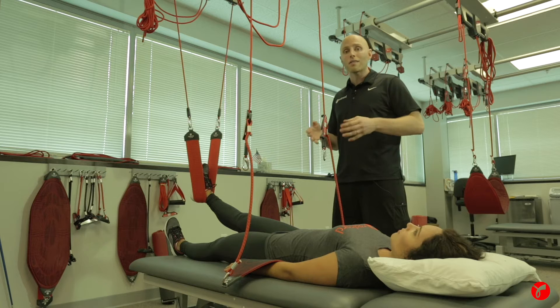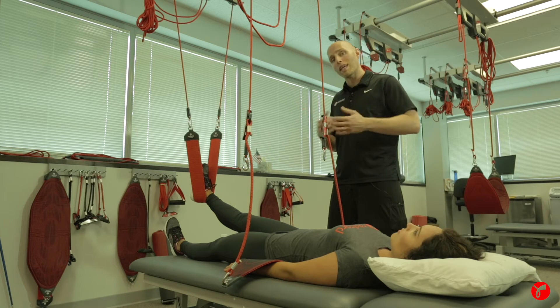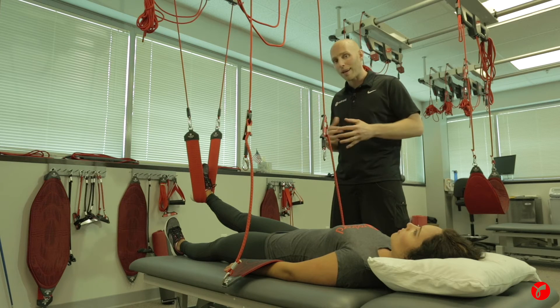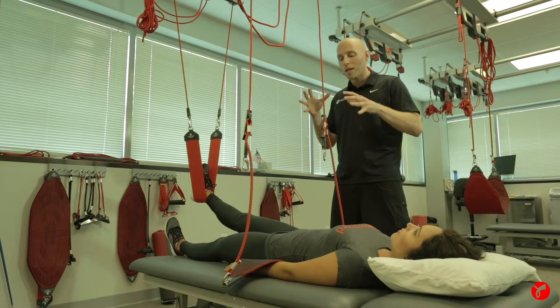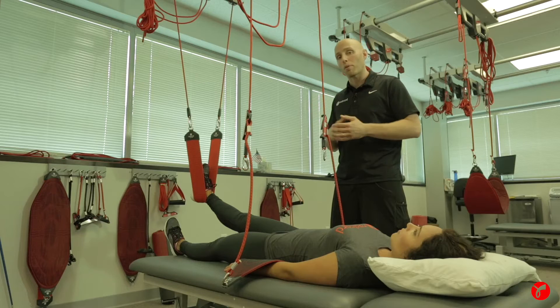It's also fantastic in a fitness setting if you've got certain people that want to get into closed kinetic chain body weight-bearing exercises but are just not strong enough yet — whether this is youth, people that have been more sedentary, or obese. We can utilize the bungees to off-weight body weight and get them to exercise with proper technique.